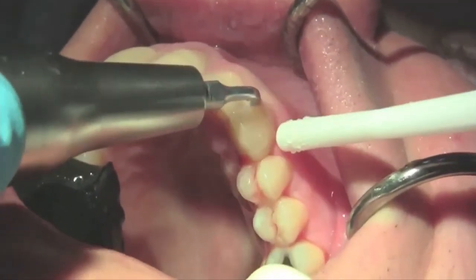And it's very important to actually penetrate at the angles. Wherever your facial table and your mesial table meet, exactly at the corner of each table is where you're going to be utilizing those tips for that penetration that I was mentioning. So any single one of the corners would be the ideal place for the position and for the activation. If you have to compromise, then you start by compromising on the lingual table, then on the distal table, then on the mesial table, and you always protect your facial table.